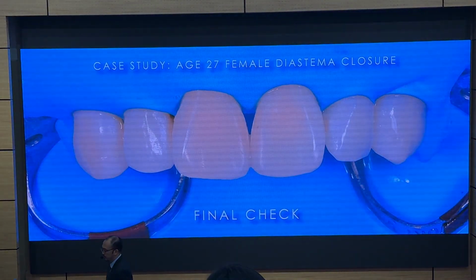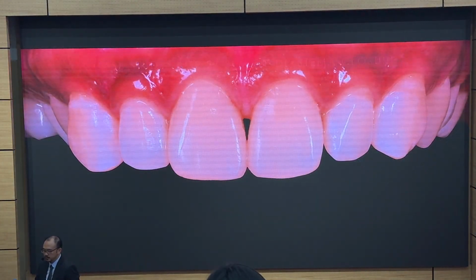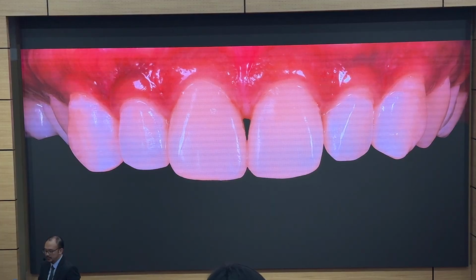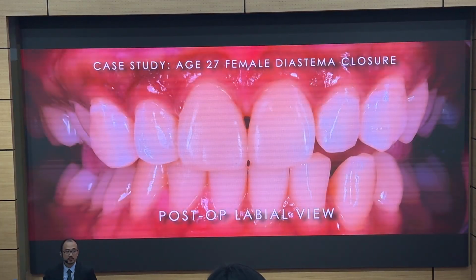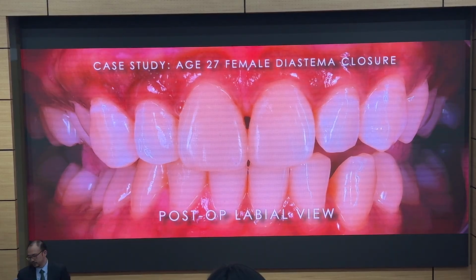So, this is what it looks like afterwards. This is how it looks like with her biting down on the front teeth. So far so good? Good.